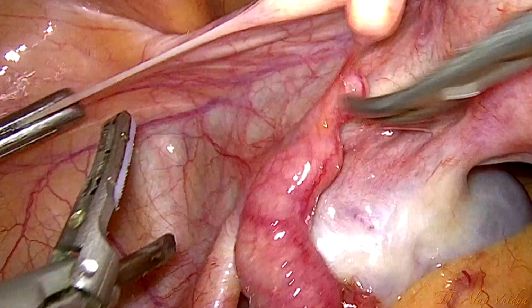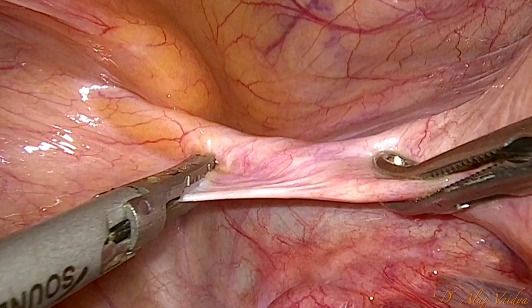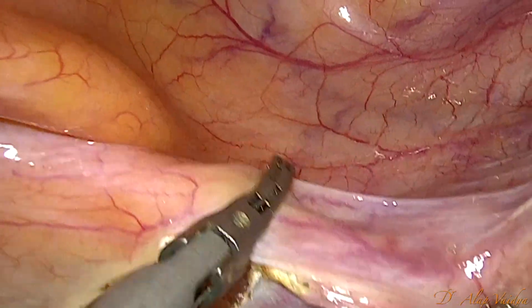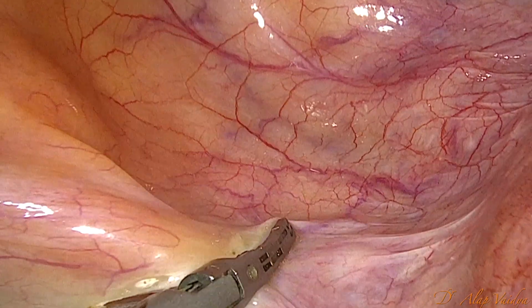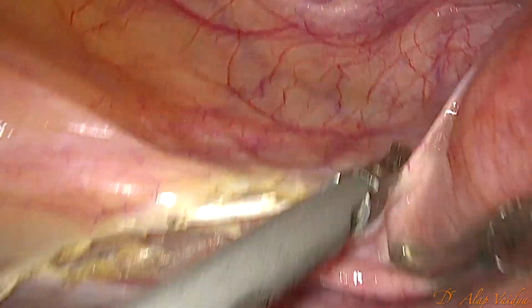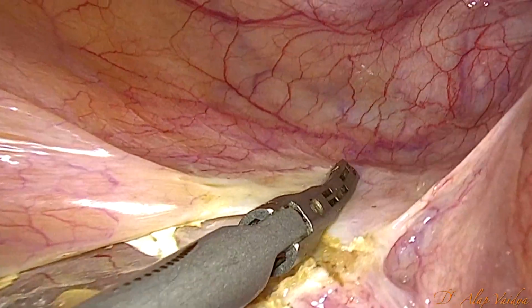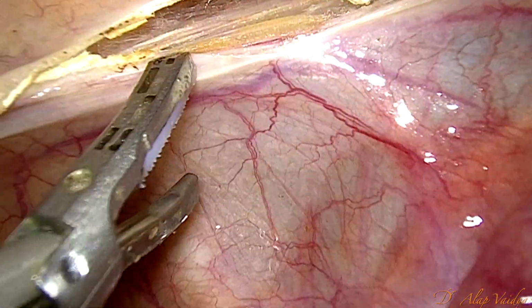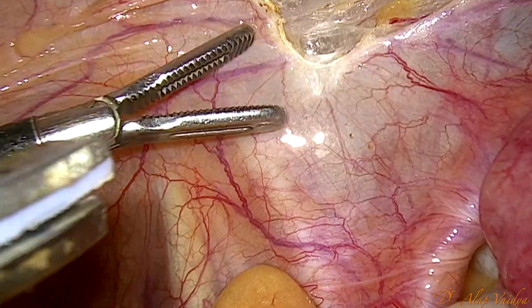This is called the lateral approach because when we start cutting the peritoneum and start going retroperitoneally, we are starting lateral to the IPL ligament. We are cutting the round ligament here. So this approach is more suitable when we have to remove the ovaries.